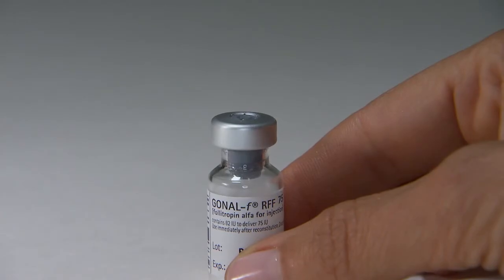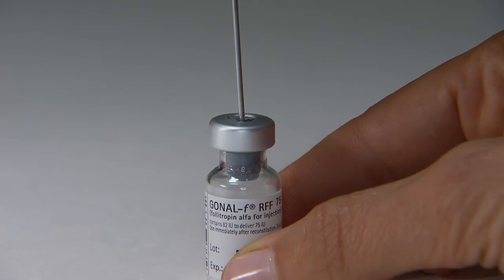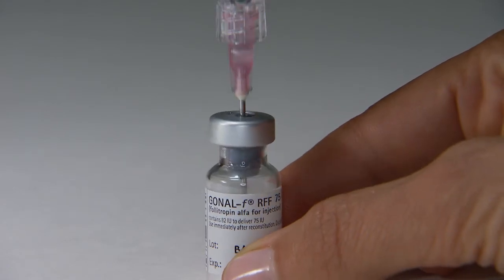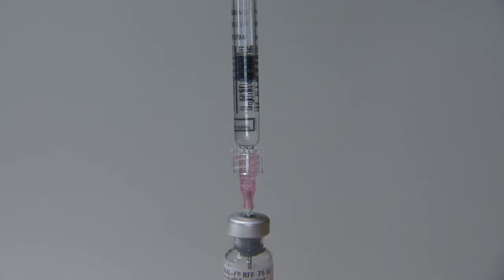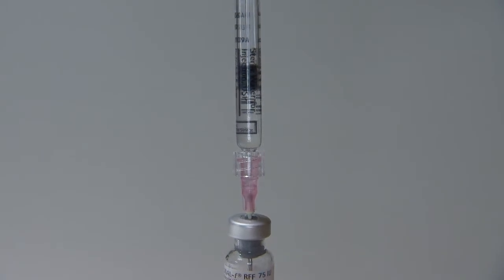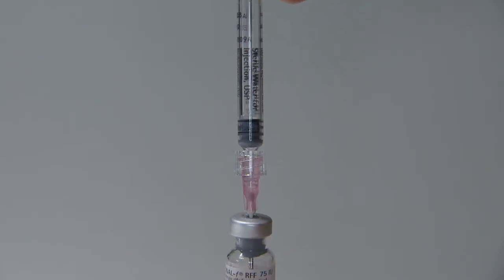With the vial of Gonal F RFF powder on a flat surface, insert the needle of the pre-filled syringe straight down through the marked center circle of the rubber stopper. Slowly inject the water into the vial by pushing down on the plunger. Leave the 18 gauge 1.5 inch needle and syringe in the vial.